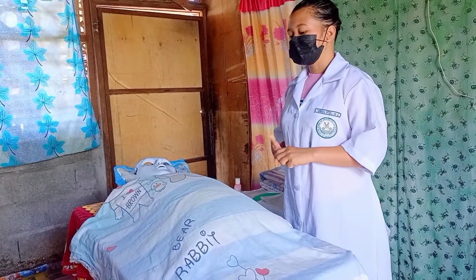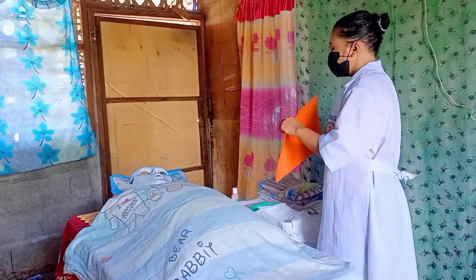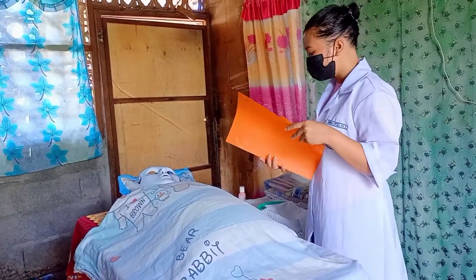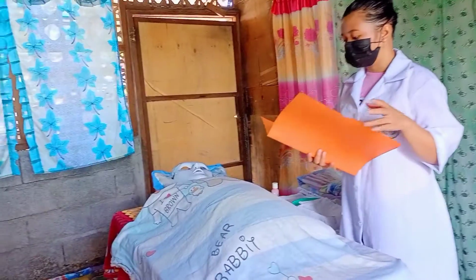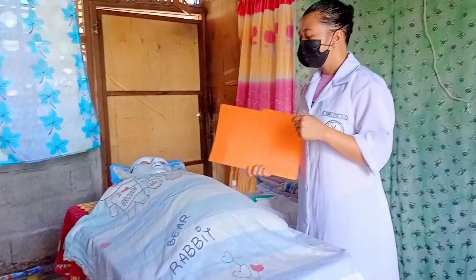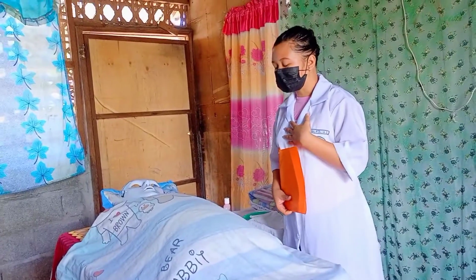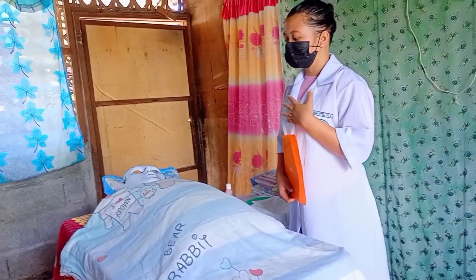Next is verify the doctor's order to ensure the legality of the procedure. Next, explain to the client what we're going to do and why it is necessary, to gain cooperation from the patient and reduce anxiety. So, ma'am, andito po ako ngayon po, ma'am, para po sa iyong urinary catheter po.